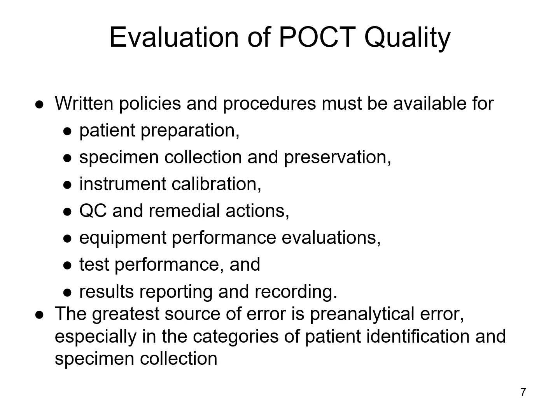But regardless of what sort of certificate you have, CLIA does state that you must have written policies and procedures in place. And the things that must be included in that procedure are things like the patient preparation, sample collection and preservation. So how long can you store that sample? How long is it good for? Instrument calibration, if it's required for that machine, any sort of QC that is required, along with any sort of remedial action. What do you do if QC fails?